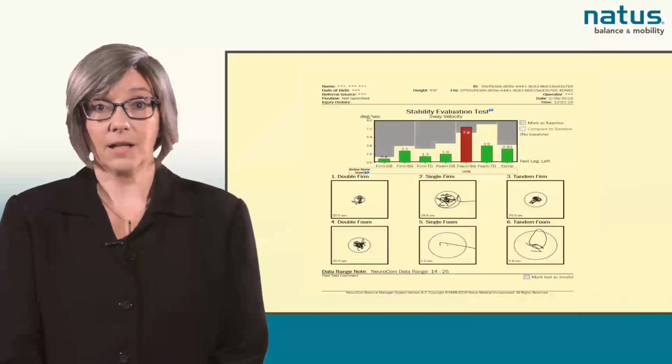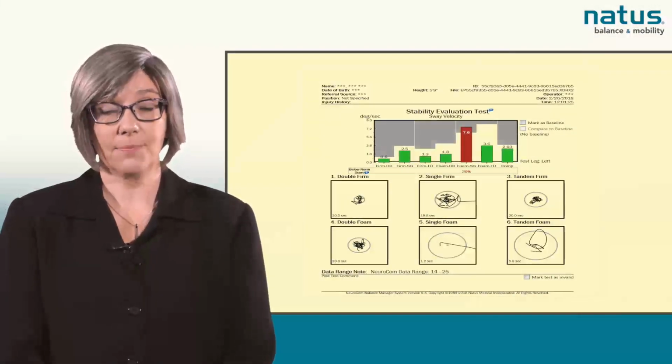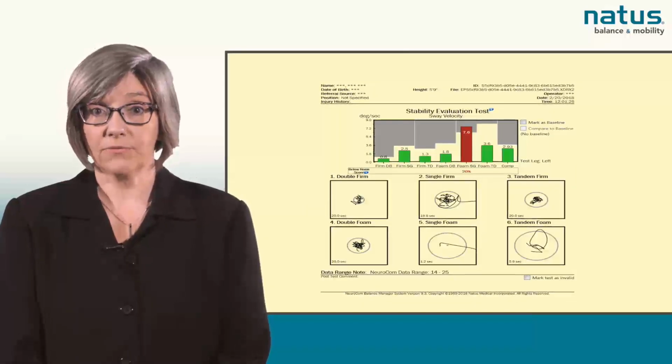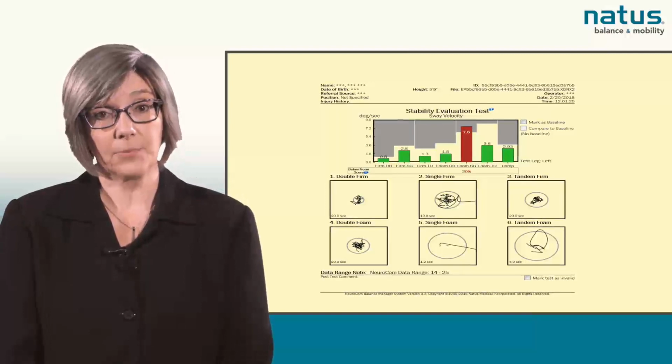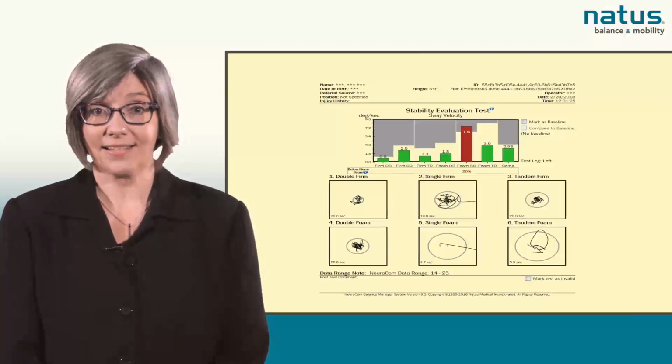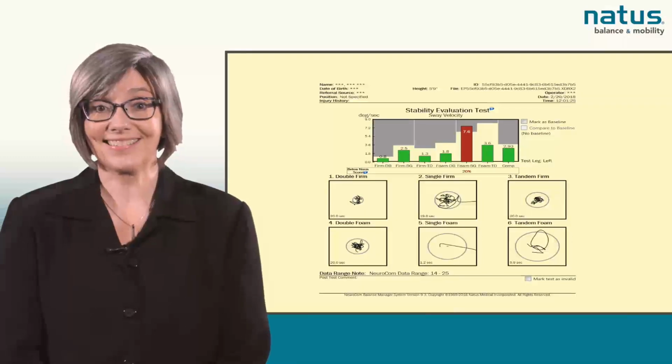Now that the test is complete, it's time to analyze the results. This is an example of a SET protocol report generated by the Balance Manager software. This section of the video will review what each data section on the report represents, as well as how to interpret the results and determine the next steps for patients with impairments.